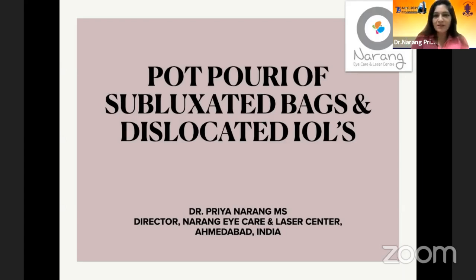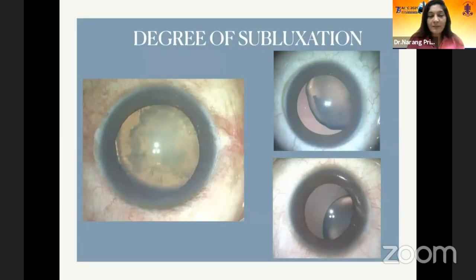Thank you for allowing me to present this potpourri on subluxated bags and dislocated intraocular lenses. Let us go through this entire scenario. The management in these cases is always challenging, and it depends upon the degree of subluxation of the capsular bag. You decide what kind of procedure to go ahead with, what other intracapsular devices you are going to use, and how you're going to manage the case. Every case is a challenge, and you need to optimize your surgery to give good results to your patients in the post-operative period.